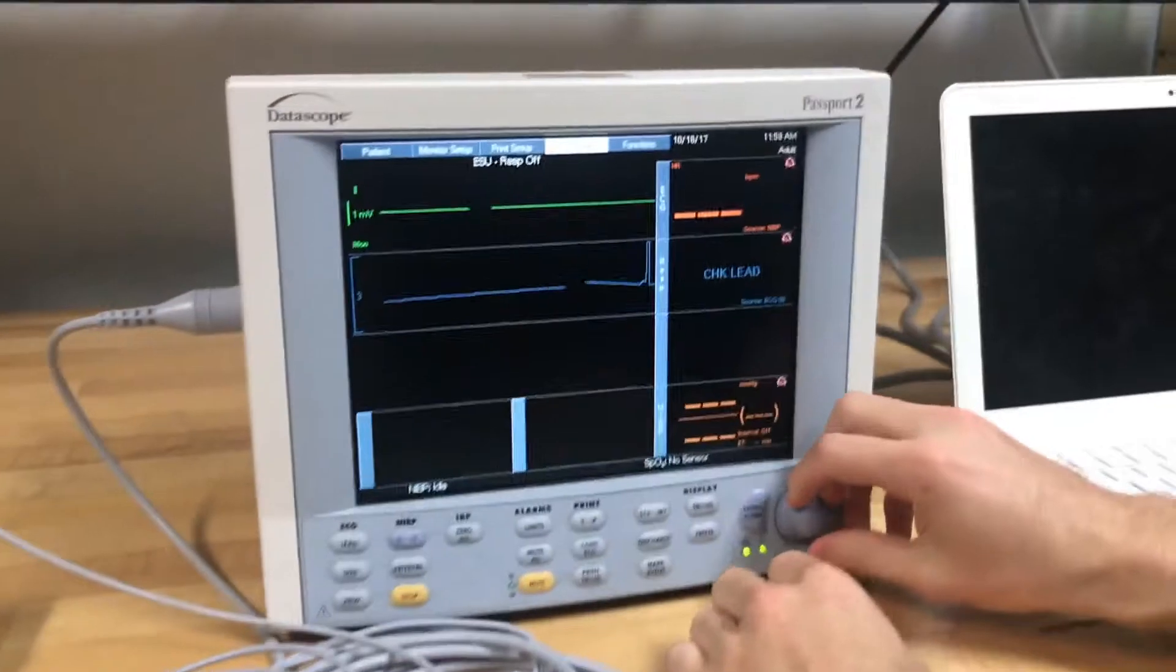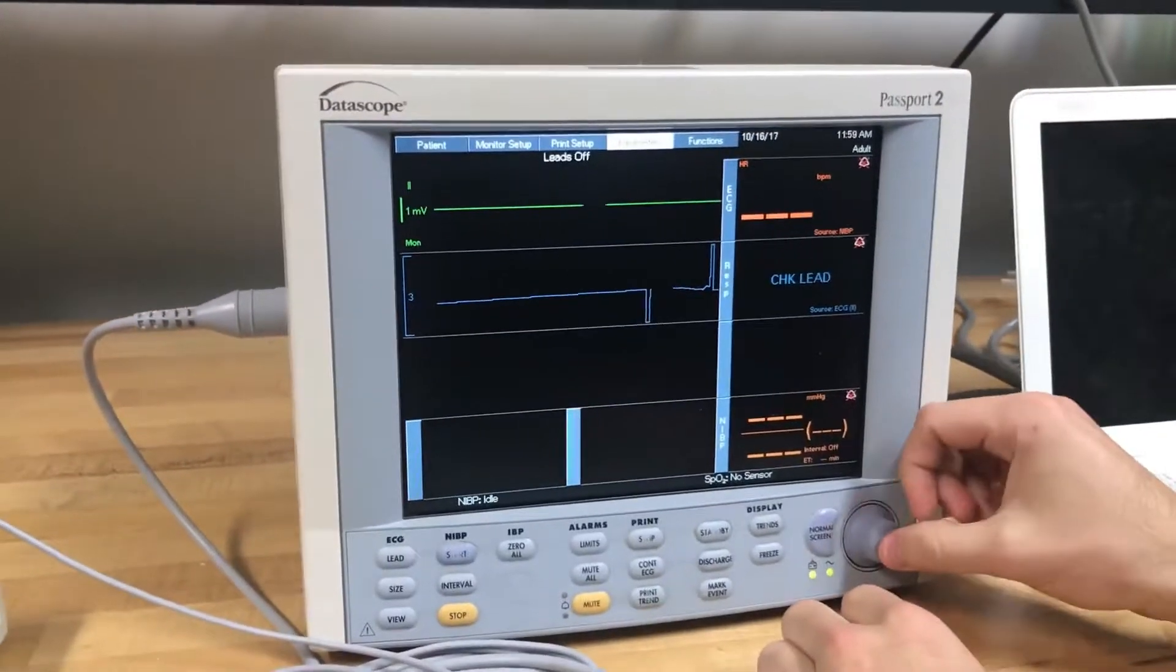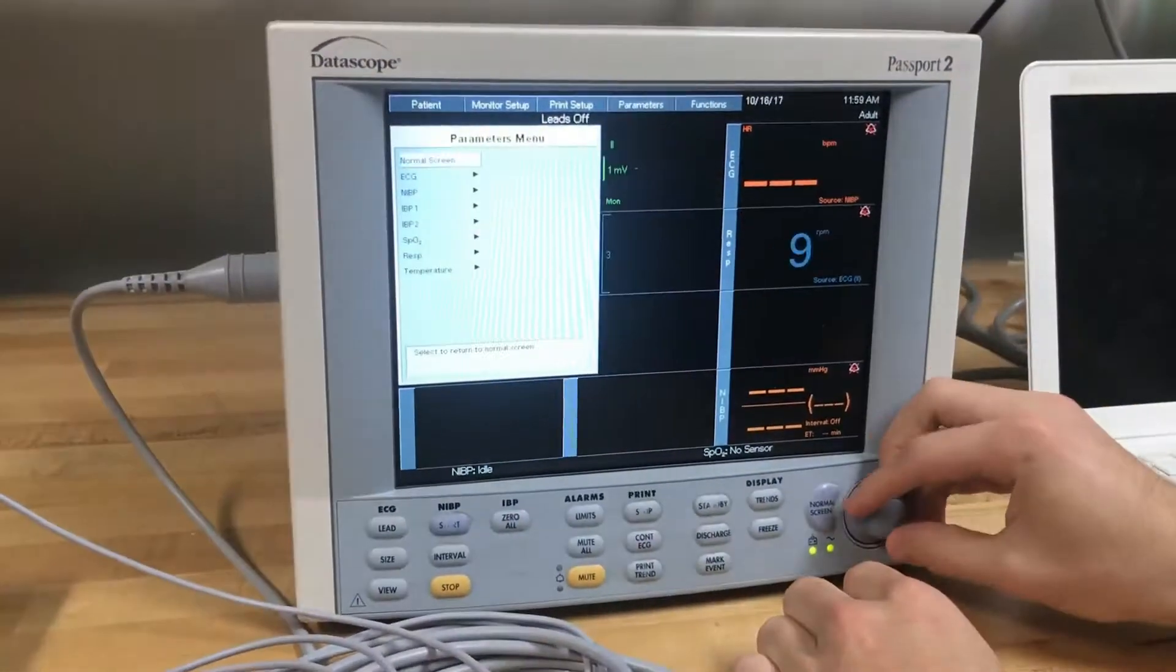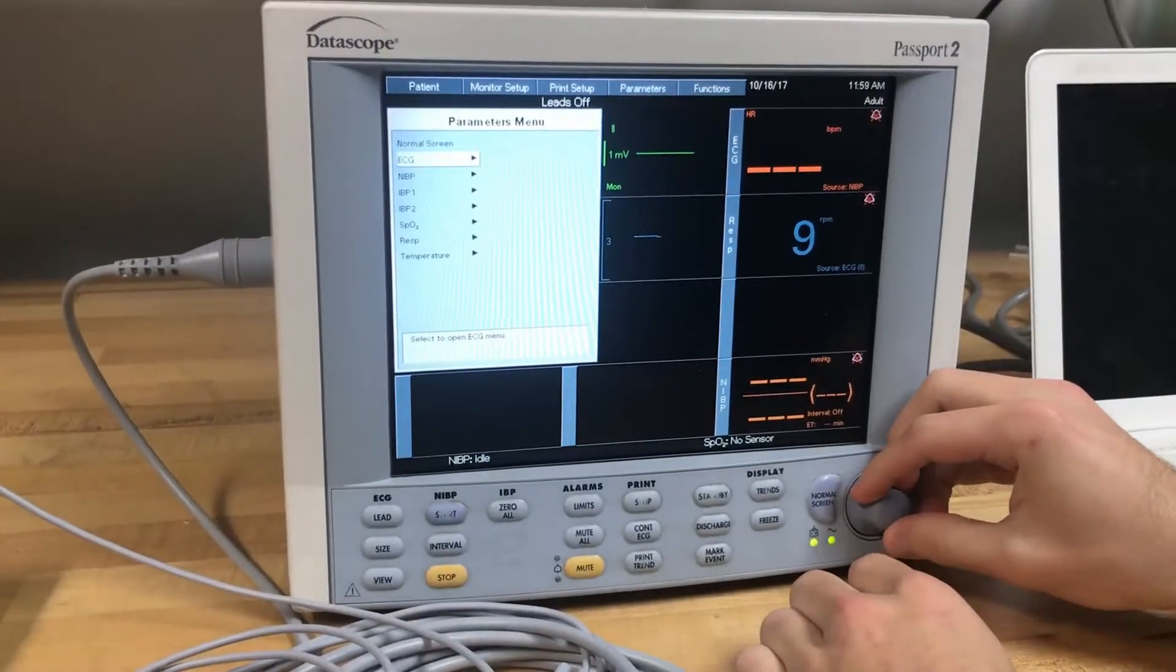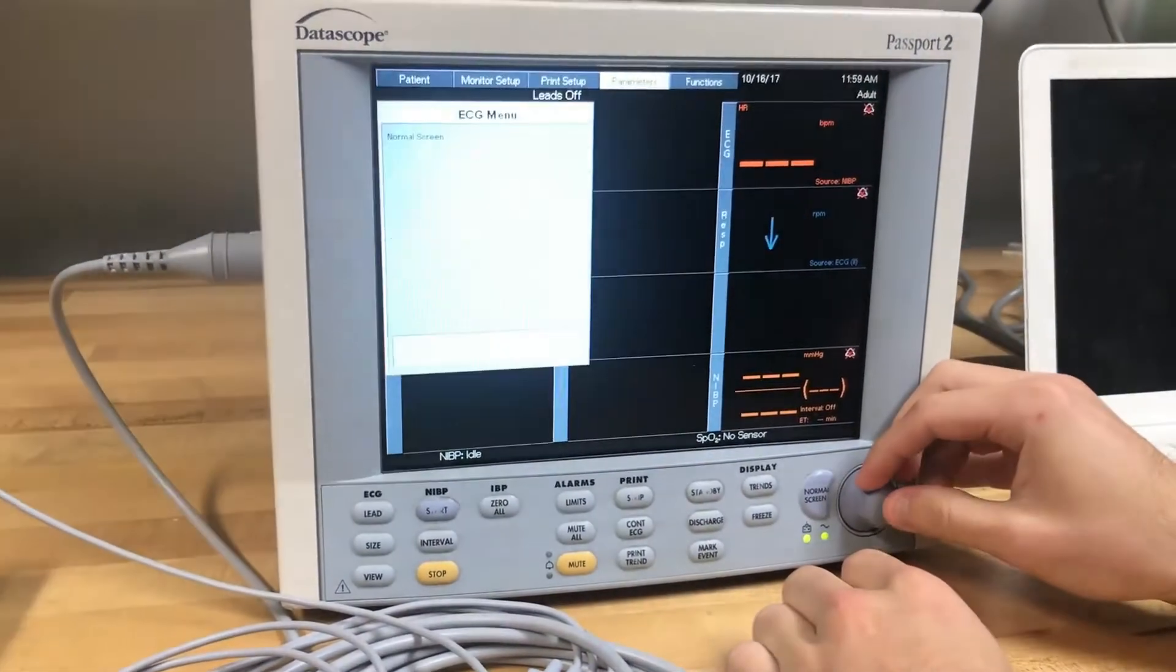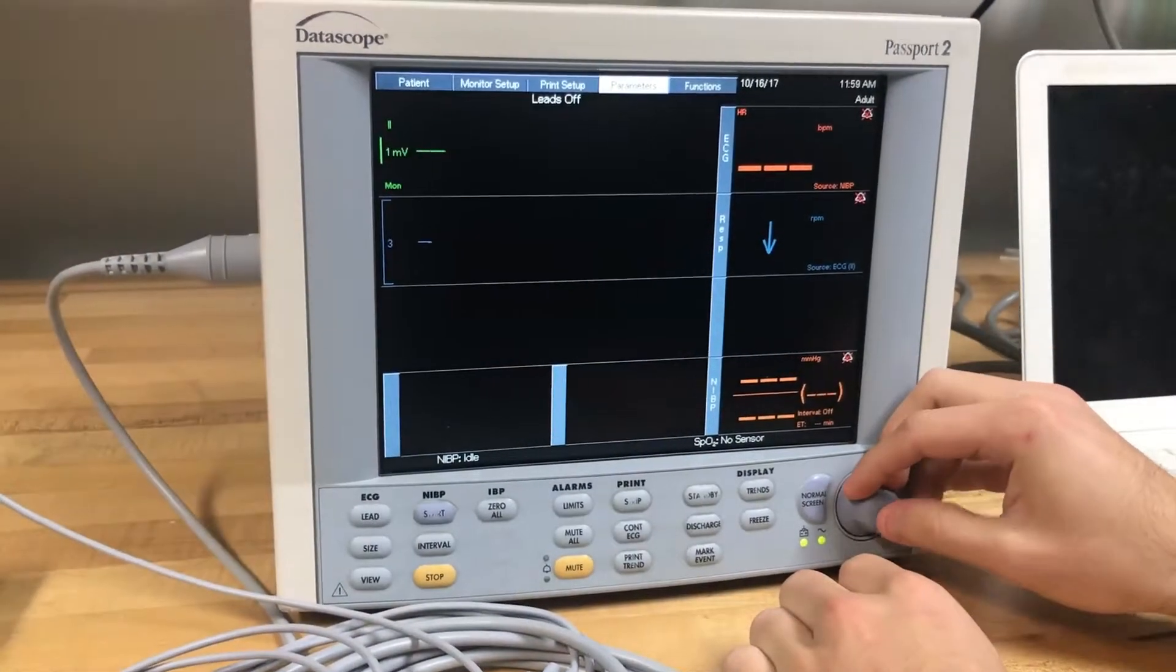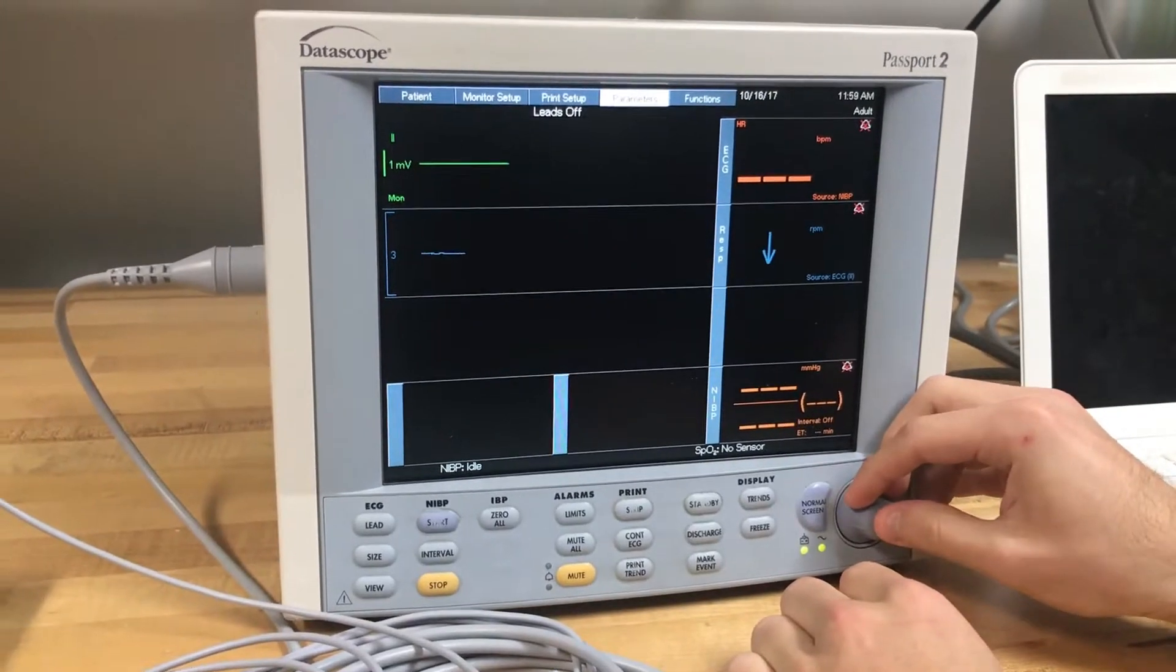If the ECG still isn't reading correctly, go to the main screen. Scroll over to the parameter section and hit select.